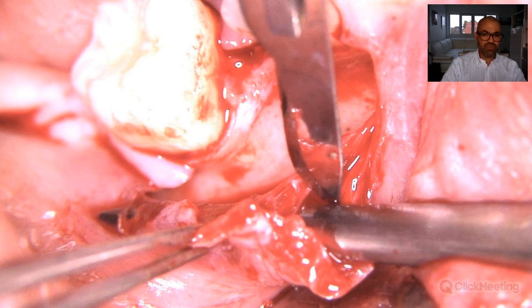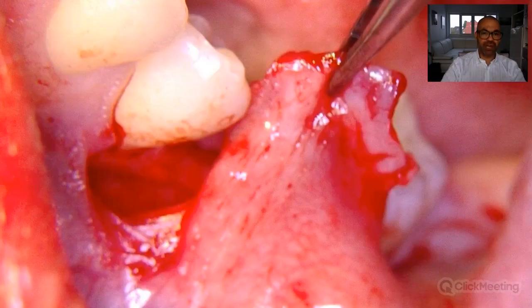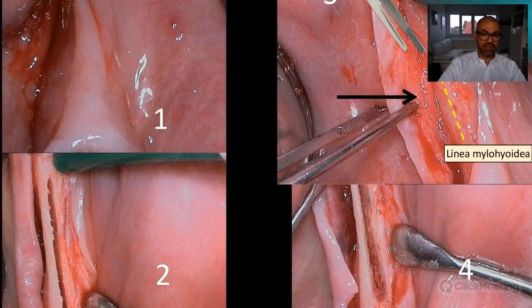So once I have separated the tissue, now you can cut the periosteum that is now underlying your scissor, and then you have a very, very mobile flap that is created, and that makes sure that your graft will be covered efficiently. And this is, of course, done previously to any augmentation, because I don't want to manipulate the tissue once I want to close my flap or my surgical site as fast as possible.